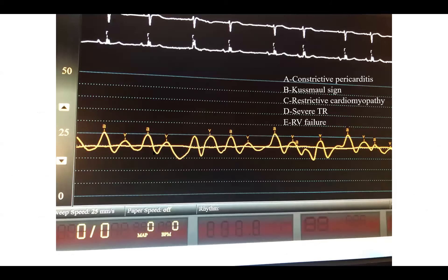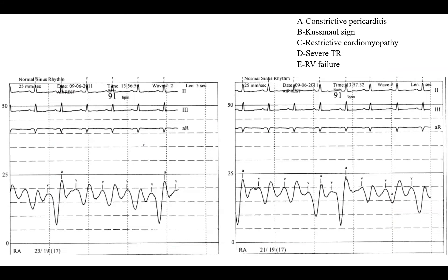I'll make it easier with this tracing — from another patient but similar. I made it easier by showing you the mean line. The RA pressure is elevated without respiratory variation. So it's an elevated pressure — that's the first thing you notice. But importantly, the mean pressure doesn't change at all. You do get some dipping — a wave dipping — and that wave is a Y descent: it comes after V wave, before the A wave. So you have intermittent dipping of the Y descent, but the mean pressure is invariable.